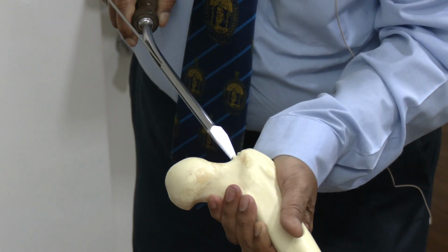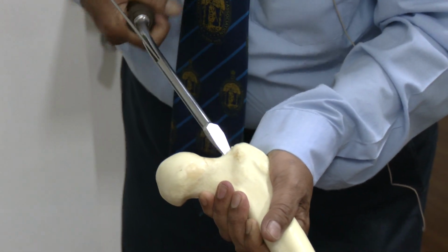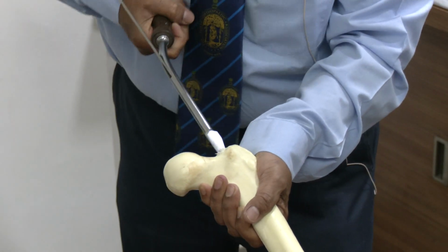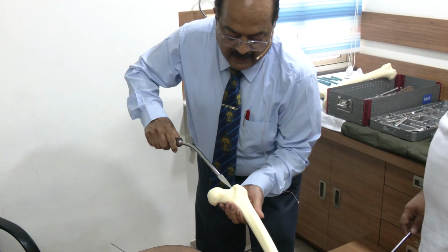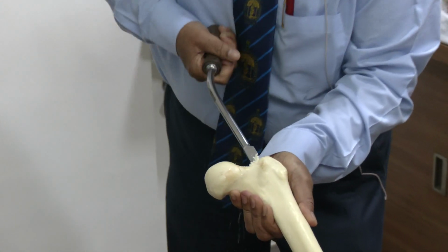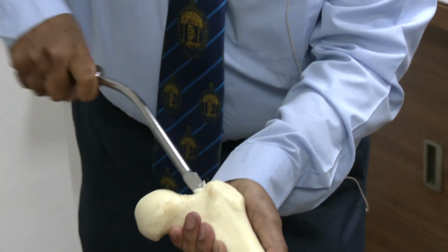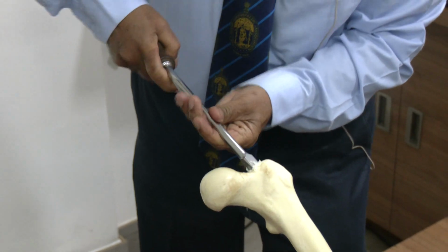Many people pass the awl first and through the awl they pass the guide wire, but I prefer to pass the guide wire first, because if you make a large hole wrong with the awl, then it will be very difficult for you to pass the guide wire. So it's better to always pass the guide wire first, confirm that they are properly placed, then you pass this awl. So now we have used the awl to make an entry good enough for the reamer to go.